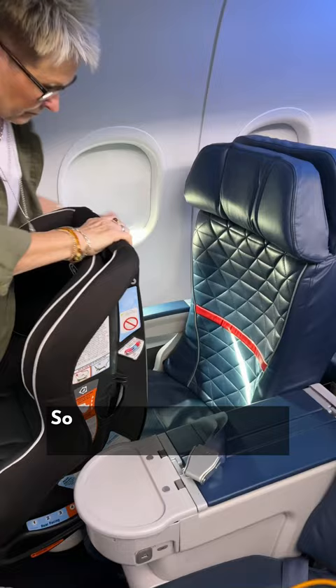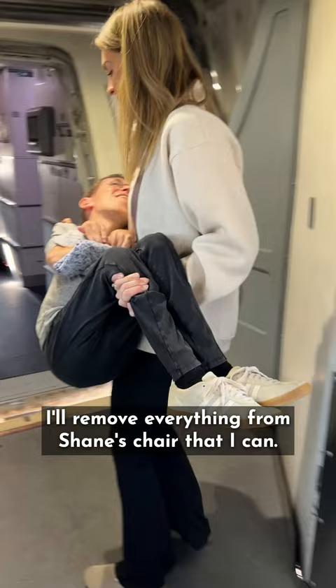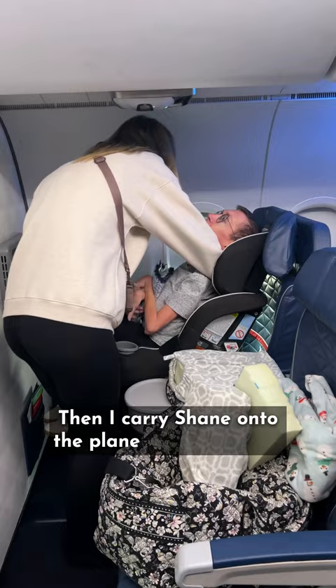So while my mom sets the car seat up on the plane, I'll remove everything from Shane's chair that I can. I take off the headrest, tape up the footrests, and unplug the power. Then I carry Shane onto the plane, and while I get his many pillows set up, my mom goes out and finishes getting the chair ready.